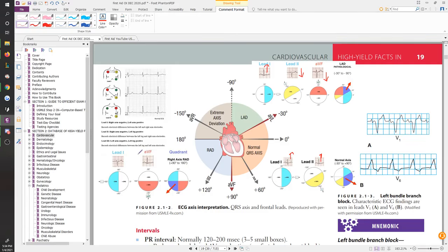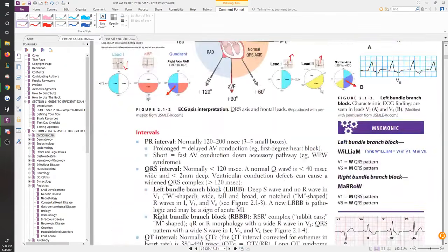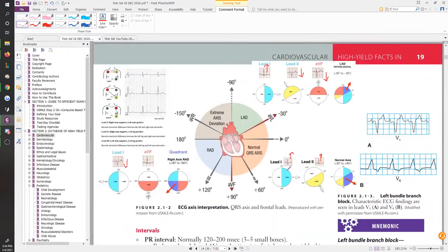And what you start noticing in comparison to the original is that lead 1 is now pointing down when it was supposed to be pointing up. Right? No other lead besides AVR and V1 should be pointing down. So as soon as you start seeing leads that are incorrectly pointing downwards, you start figuring out there's some kind of axis deviation going on.